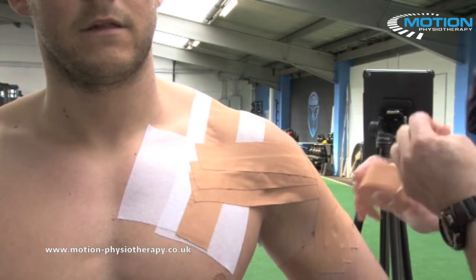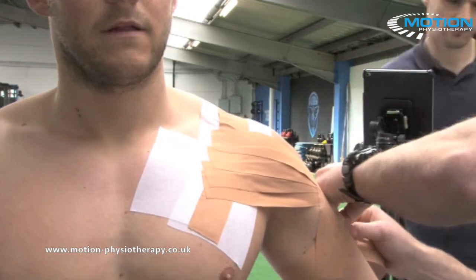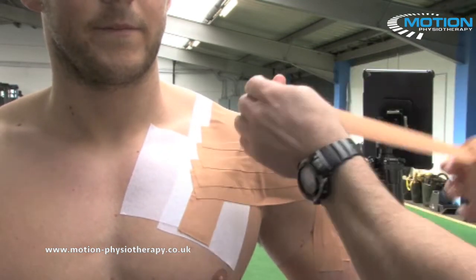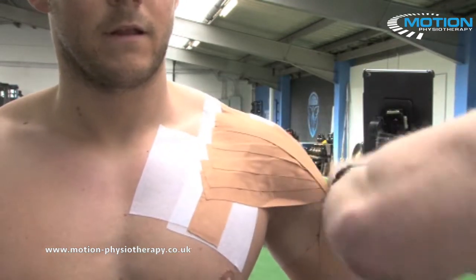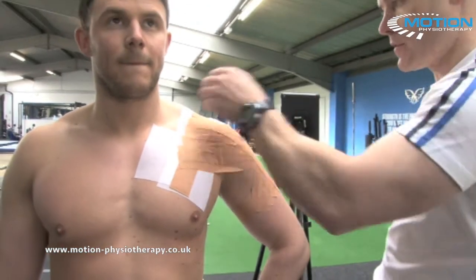Using rigid tape is going to give you a rigid end feel to the strapping. You can also use elastic tape on its own, which will give you a more dynamic, springy end feel to the technique.